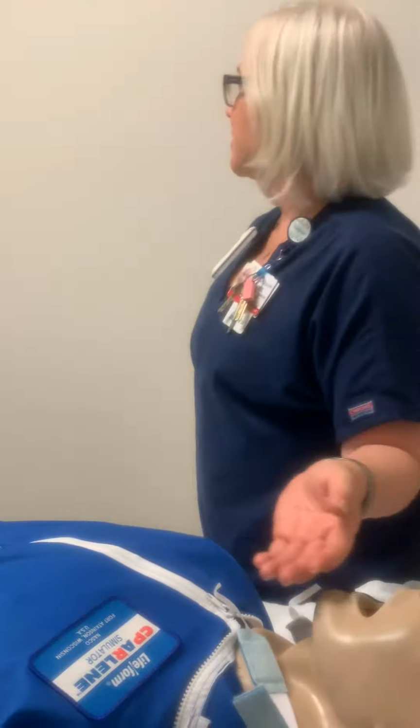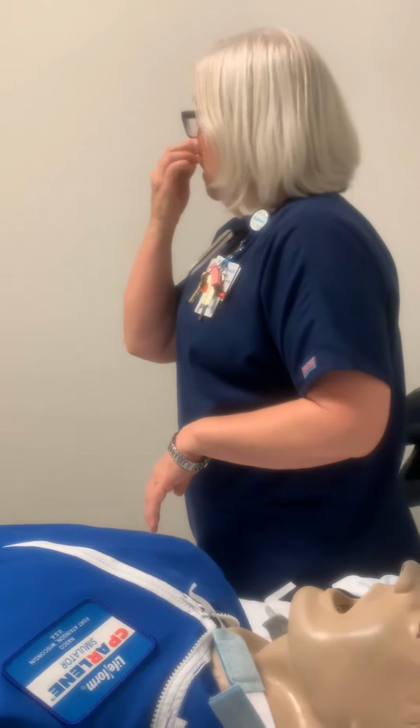Now, if you're out in the field, obviously you're not gonna run around with an ambu bag and everything else, but in here, you should always know. There's no reason you should never know what type of airway you're dealing with. Read the chart, ask the family, or talk to the physician, okay?